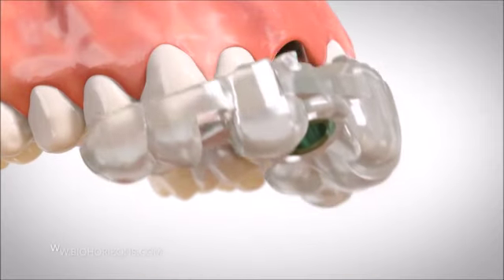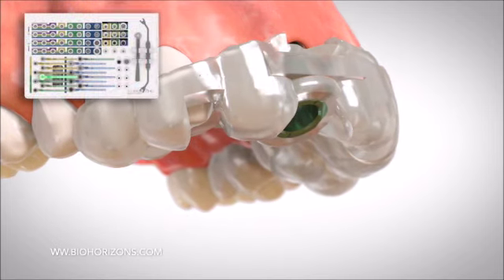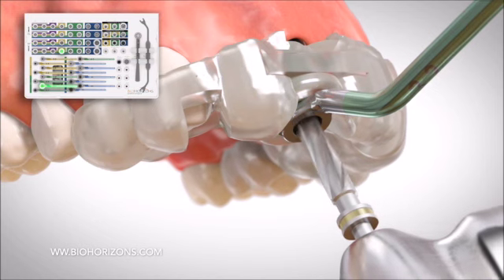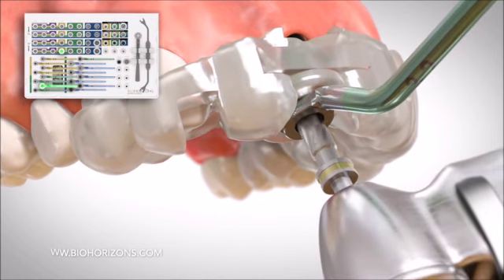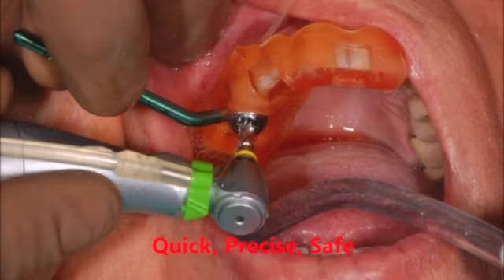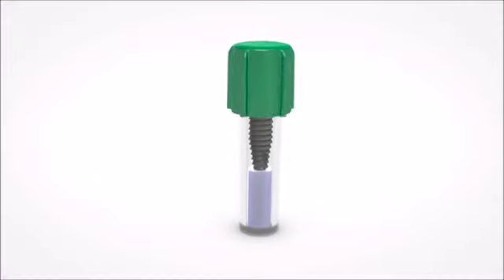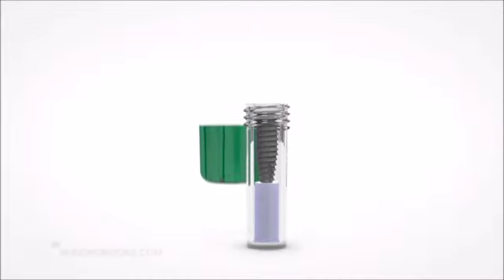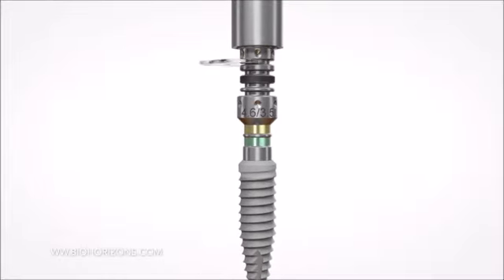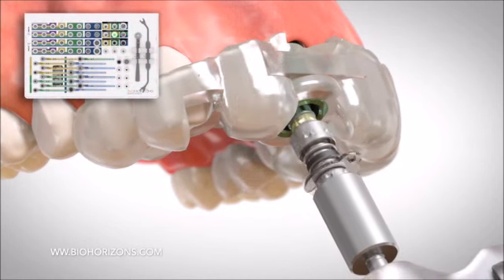These CAD CAM stents can be snapped onto the patient's existing teeth, enabling the surgeon to drill for the implant in a very precise and a pain-free manner. After the drilling is done, the implant can be placed through the same CAD CAM stent to a predetermined position which was planned prior according to the patient's CT scan.